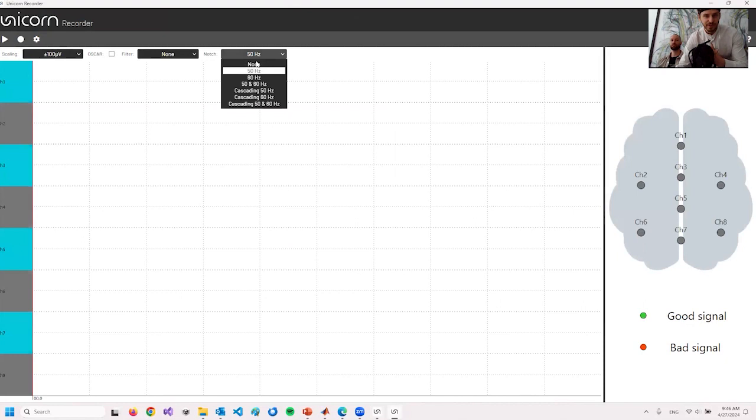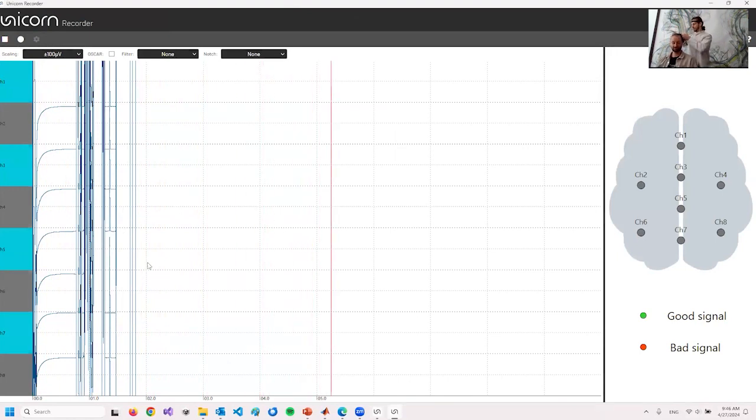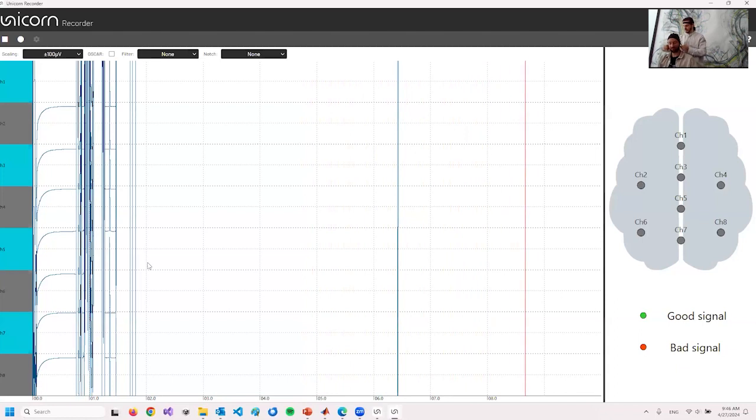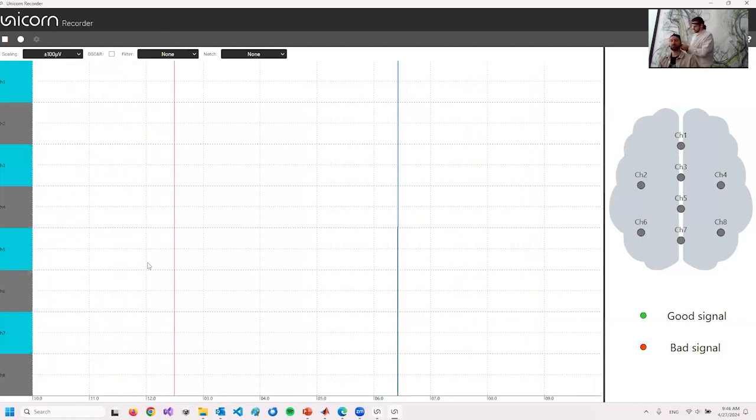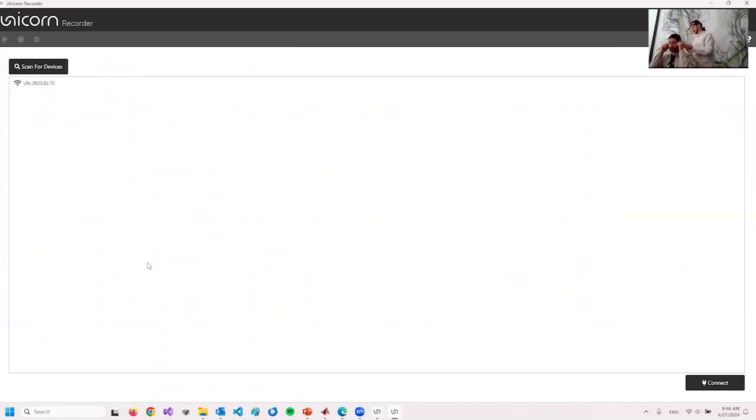So first of all, I'm removing all the filters and starting some EEG recording. And right now there's no useful EEG data yet because I'm just applying the BCI to Leo. Then I add the ground and the reference electrode. So I put two sticky electrodes at the mastoid. That's the location where there are very little electrical signals, and that's where we measure the EEG reference.